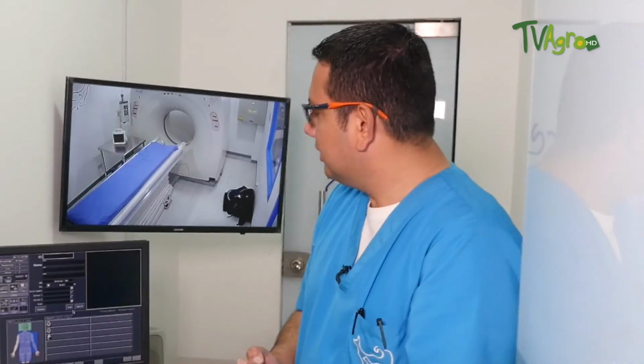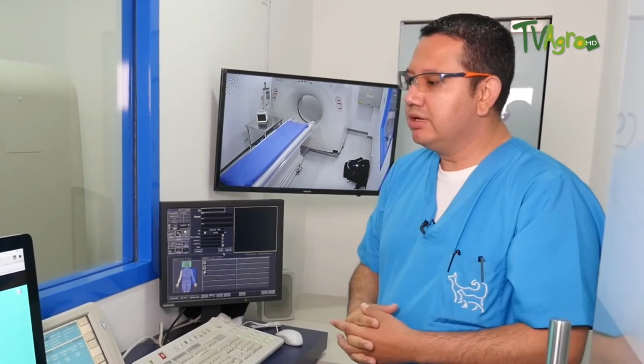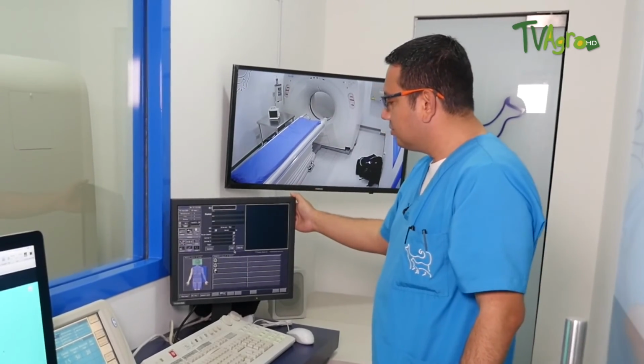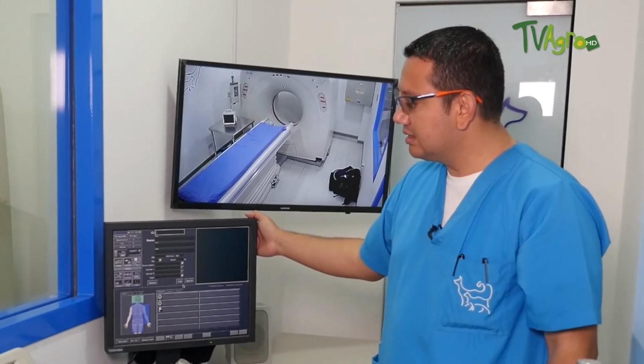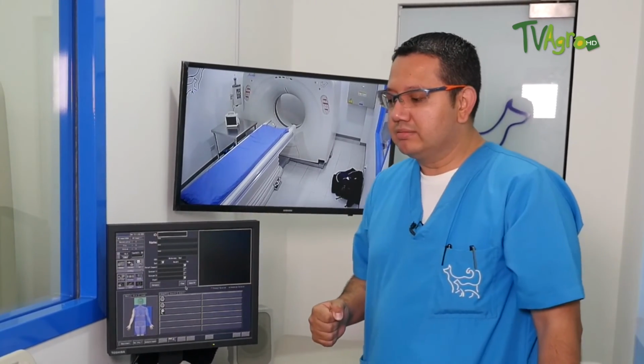Alright, here is our computer management console, where we have different equipment. We have a monitor on which we observe how the patient is, both the monitor and the patient's state when we are doing the CT study. We have the console in which we handle the computer itself, where we see the technical factors of how the study will go and how long it will last.